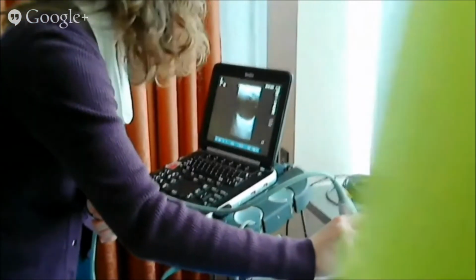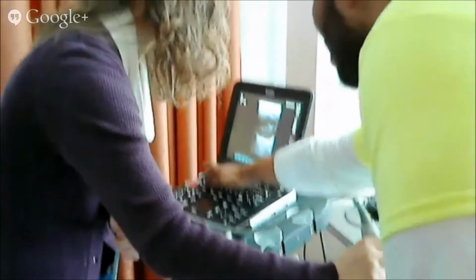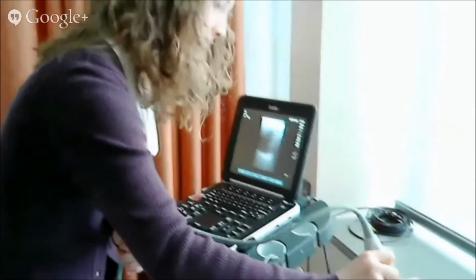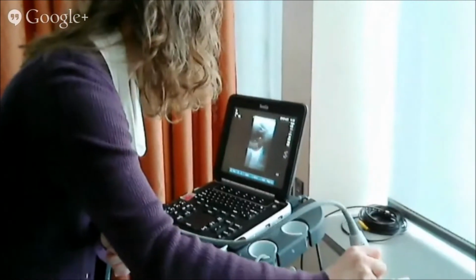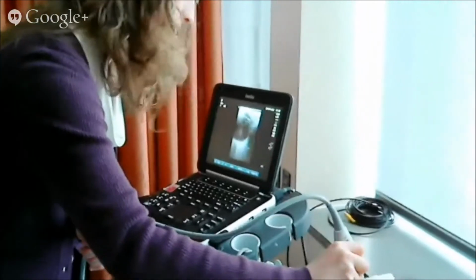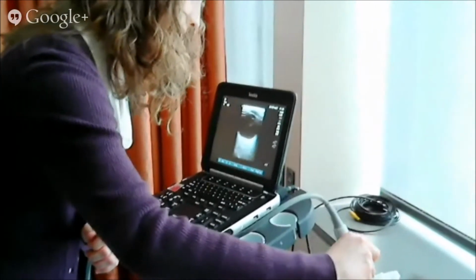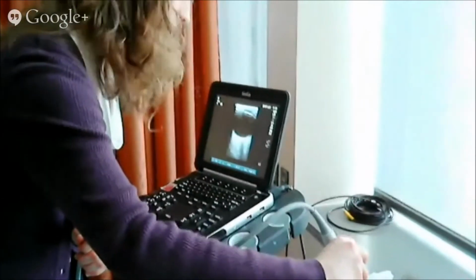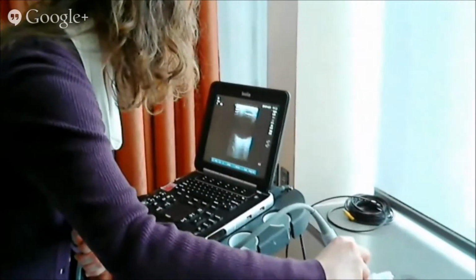I'm gonna reach over you. Pixel with the eye. I guess there's no pictures of the eye, but you can type it in if you need to, so when you save the image, you know what you're looking at, and also you can put leading edge towards head or whatever you need to orient yourself. Usually there are pictures, but this one doesn't have them.